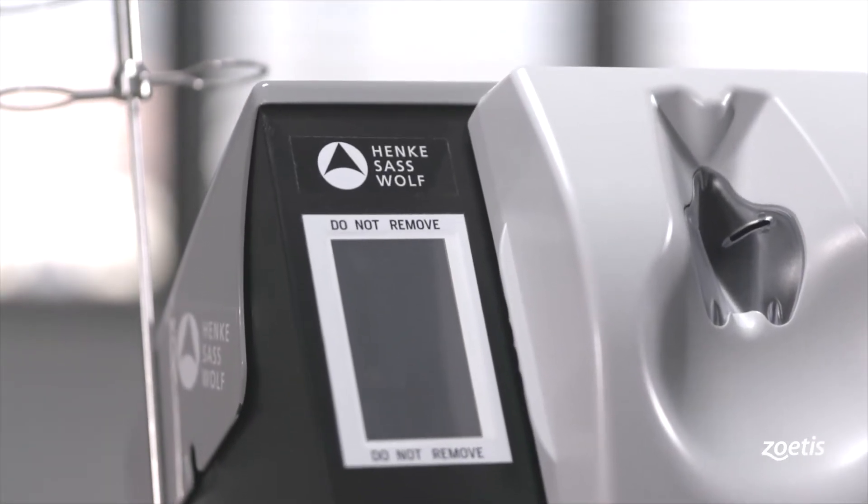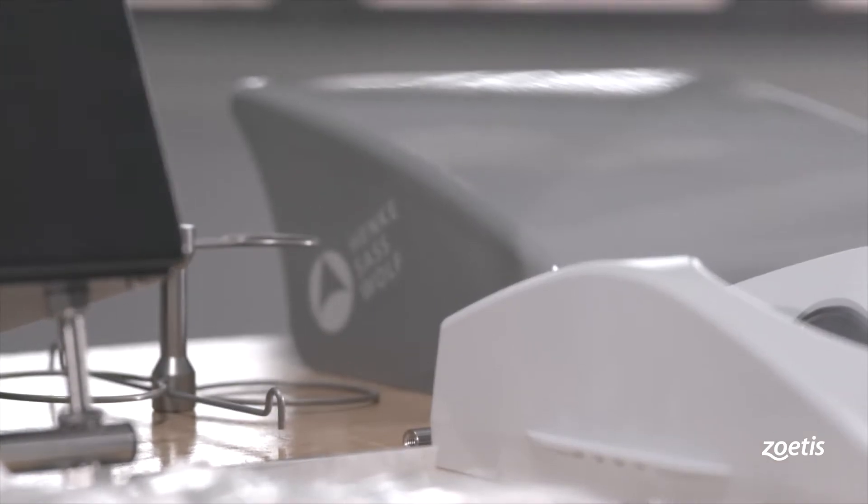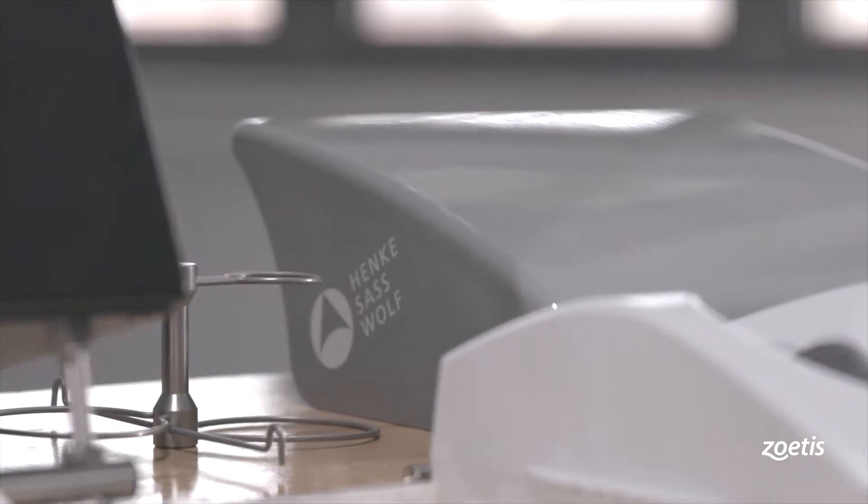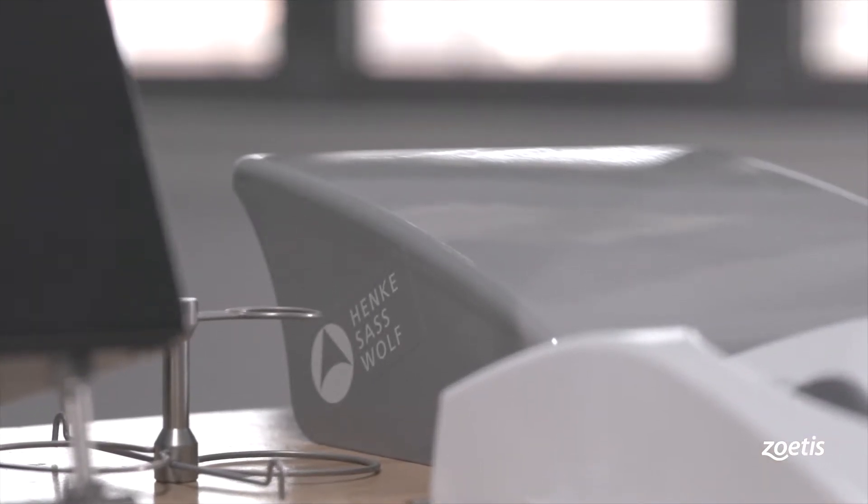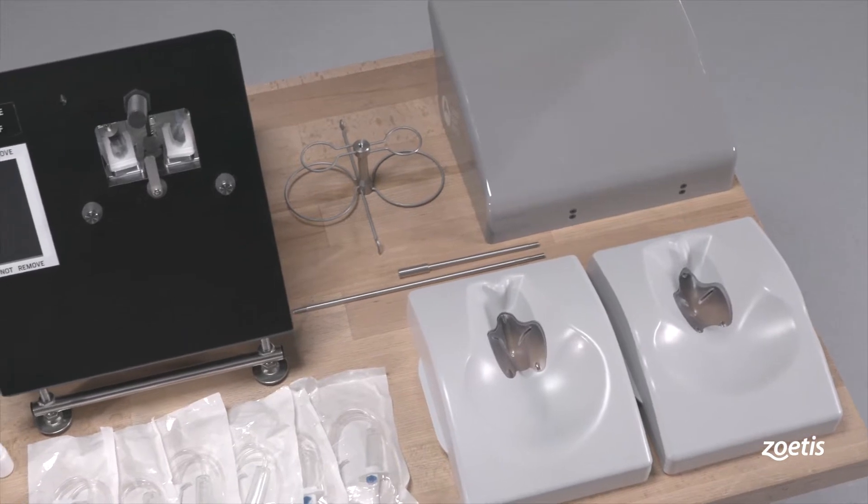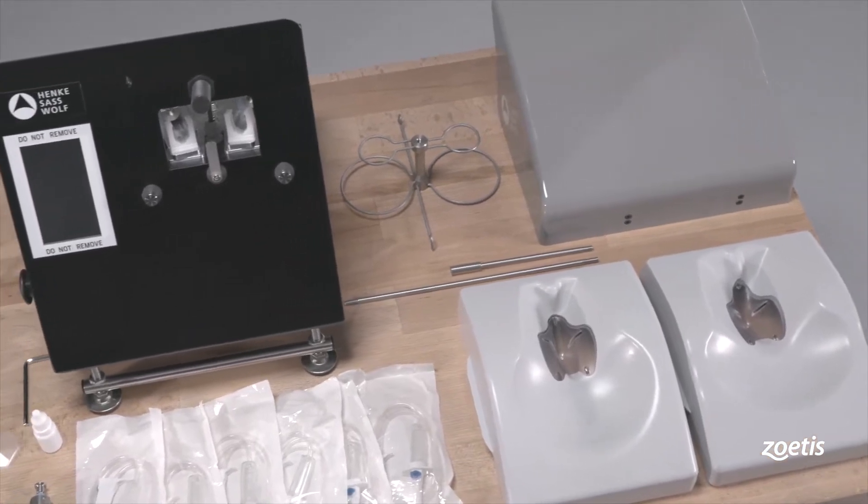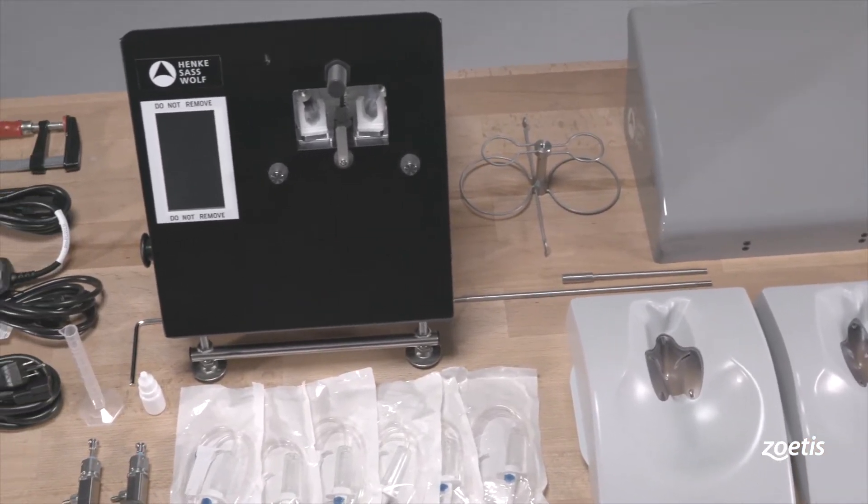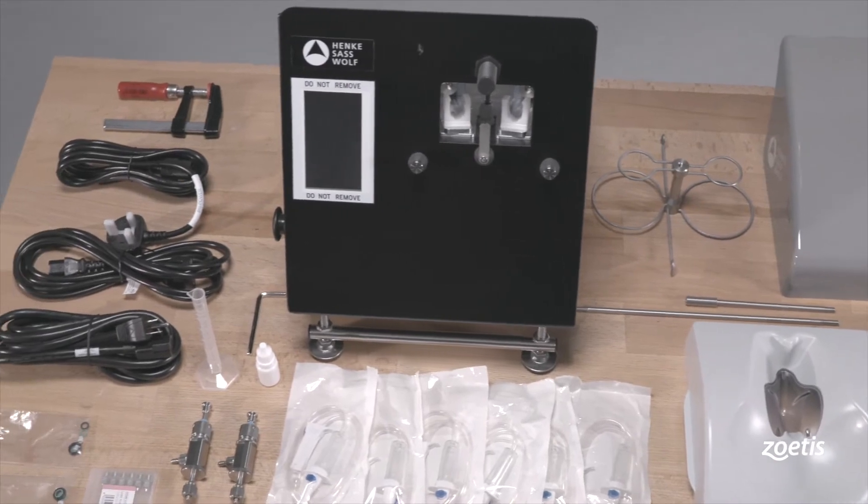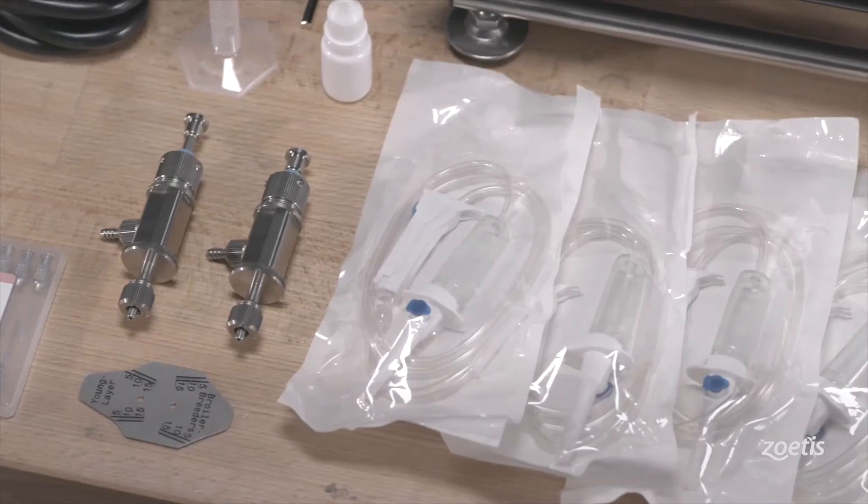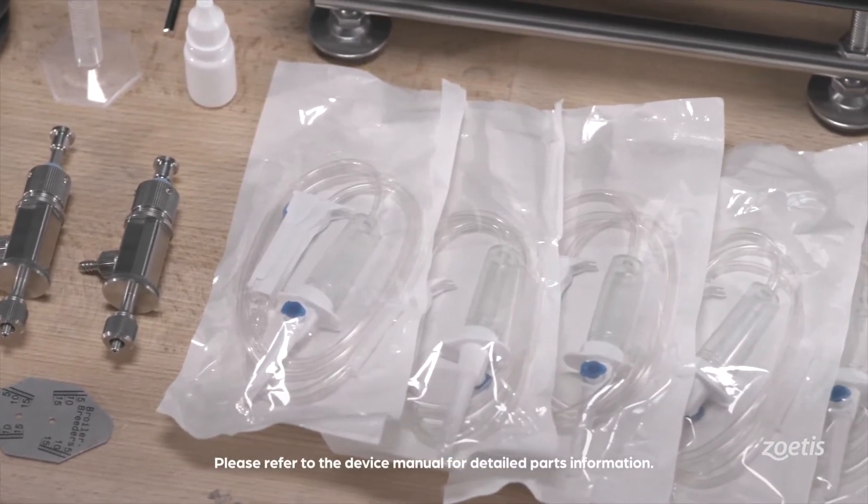The Double Breast Vaccinator is developed for efficacious intramuscular administration of vaccines in layer or breeder chickens. Before starting to operate, unpack the device and all of its accessories. Check if the materials are complete before first using.